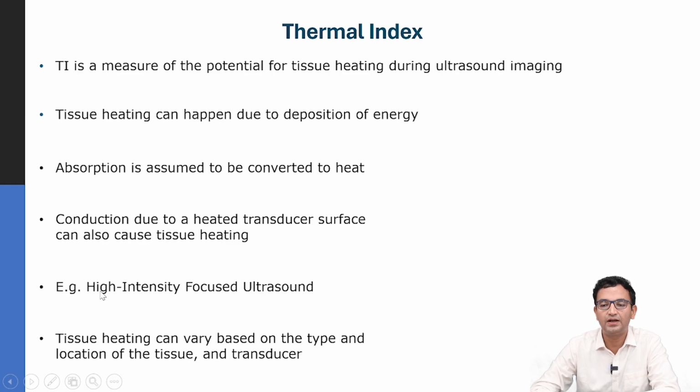So this is also an important mechanism apart from absorption deep in the body. Now the amount of tissue heating can vary with the type and the location of the tissue and the transducer being used.